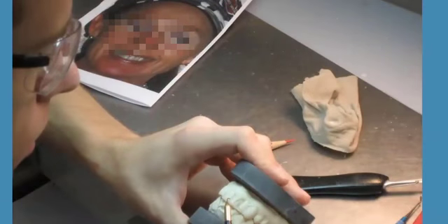Also, the technician, when they're waxing, whether it's digitally or analog, they actually have the patient's face. And we recommend full face. Just showing teeth really doesn't show us any of the facial symmetry. And the photos with just teeth aren't motivating, aren't emotional enough to patients, from our experience.